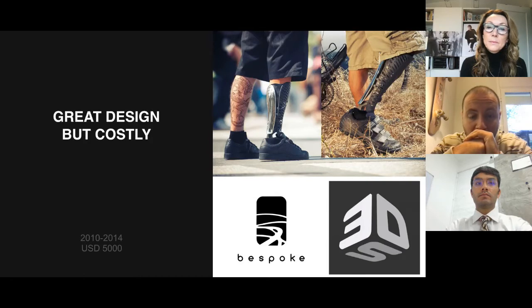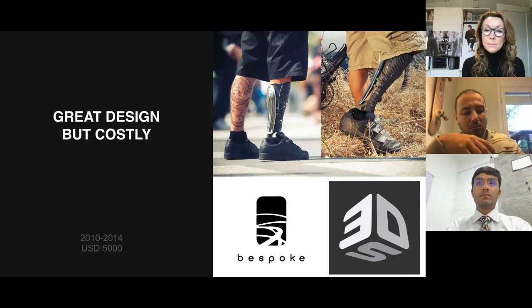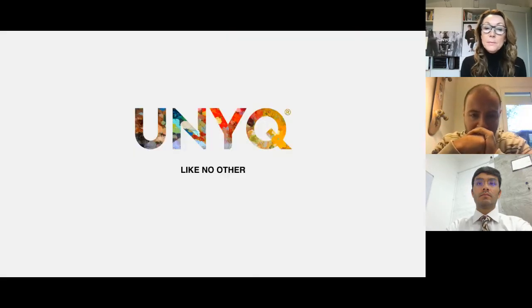These were made with SLS printers that were still patented heavily by 3D Systems. And it was not until those patents came off, in 2014, that these things became more affordable. These fairings, for instance, were $5,000, which obviously is way above what insurance companies pay for, even in countries like Germany, which have a very well reimbursed, good insurance system to cover this. Even those types of countries couldn't afford it. You had to fly into San Francisco. It was really way ahead of its time.